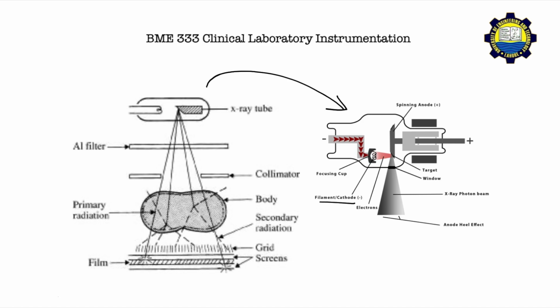The cathode filament is negatively charged, and it has an excess of electrons, and electrons accumulate on it. They get boiled off, they get a lot of heat, a lot of energy, because we are providing very high electric current to this cathode, and as a result the electrons get enough energy to move or get directed towards the anode. There's an electric field in between the two as well. And this process is called thermionic emission.